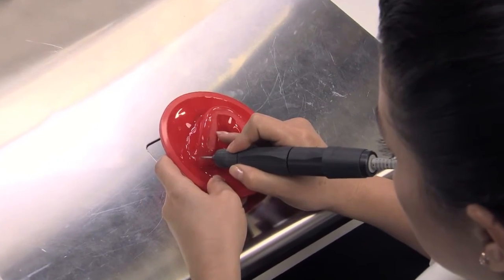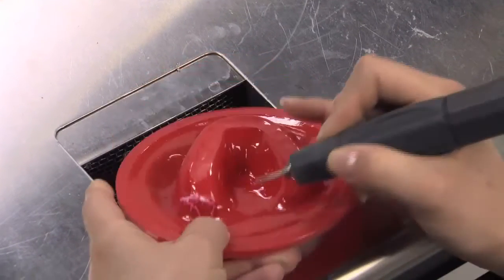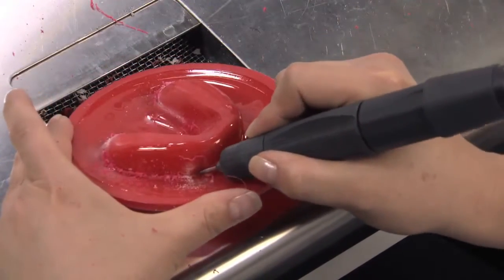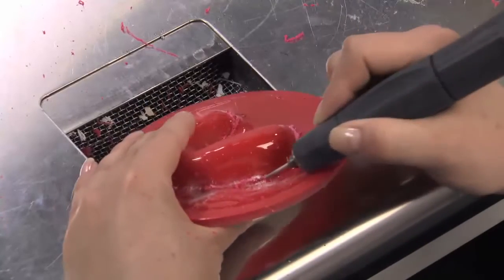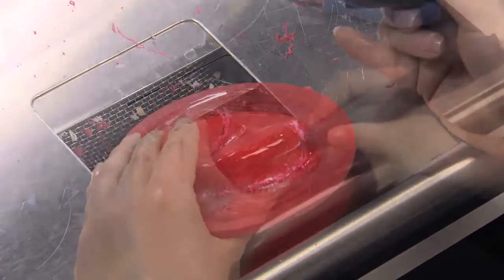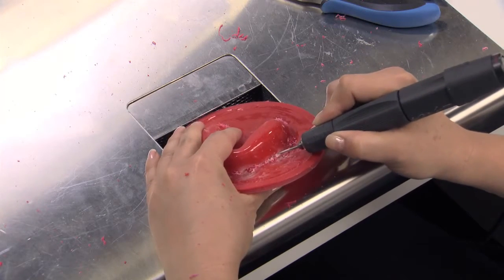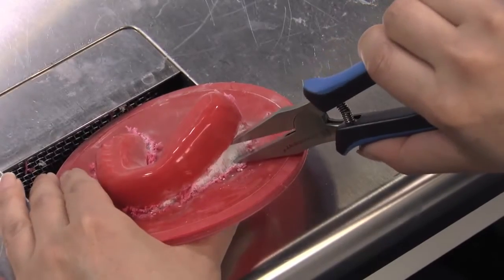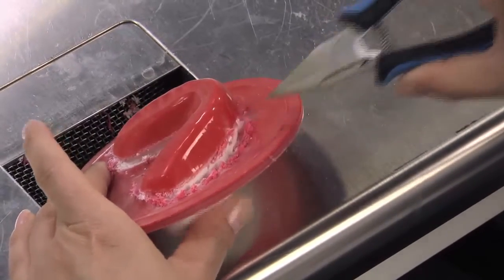Using a low-speed handpiece with a fissure burr, begin cutting out the appliance from the foil. Slowly make your way around the appliance to ensure a proper cut. If needed, keep moving along the edge until the desired line is made — it may be necessary to go around the appliance twice. Once you are satisfied with the cut, retrieve the take-off pliers. Insert the pliers into the line that was cut, apply pressure, and slowly work around the edge of the appliance until it comes free.